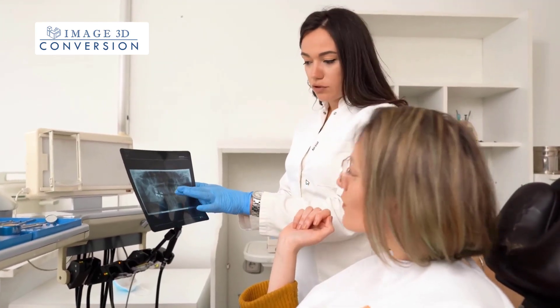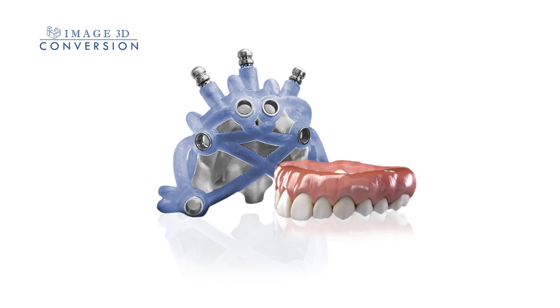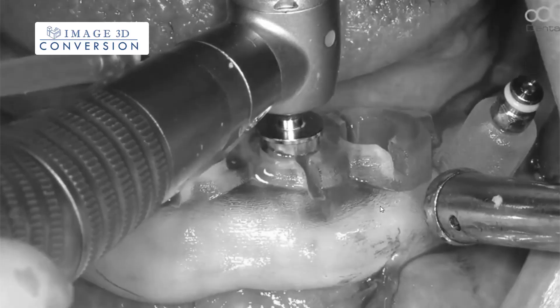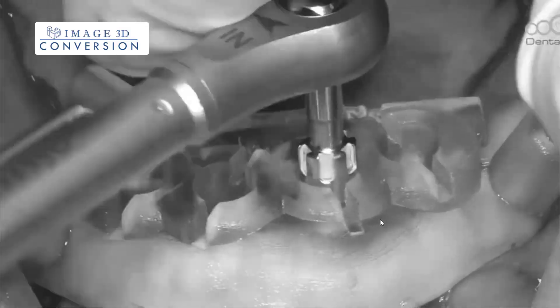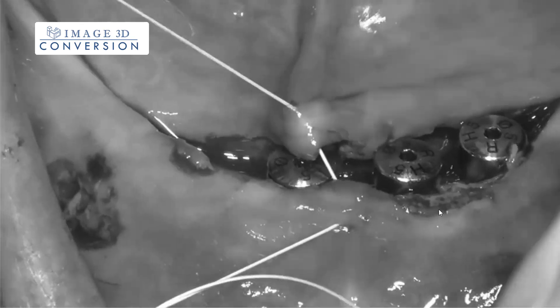We have end-to-end solutions available from the most simple to even complicated surgeries, involving bone reduction on your immediate loading cases. With our All-On-X surgical guides, dentists can perform the procedure in a faster, more efficient manner, reducing the risk of complications and ensuring a successful outcome for their full-arch reconstruction surgeries.